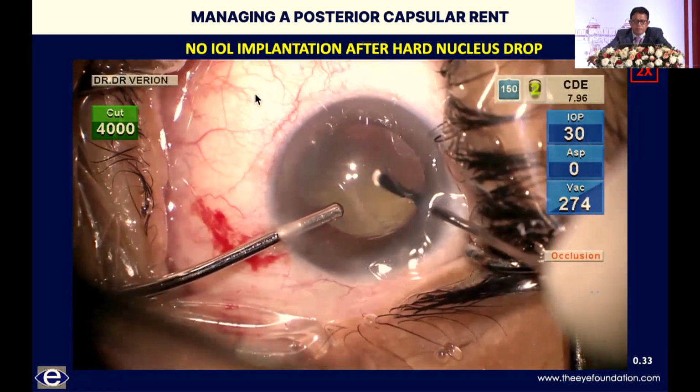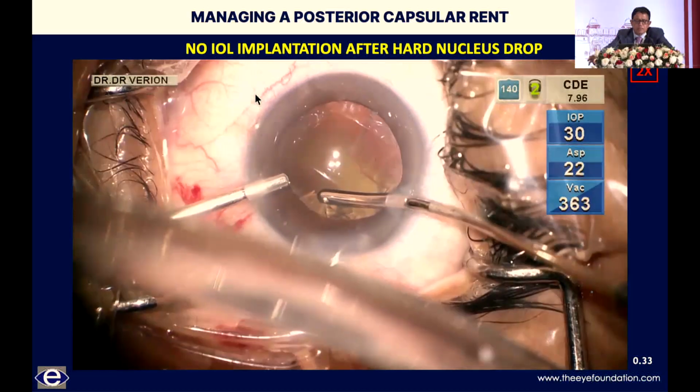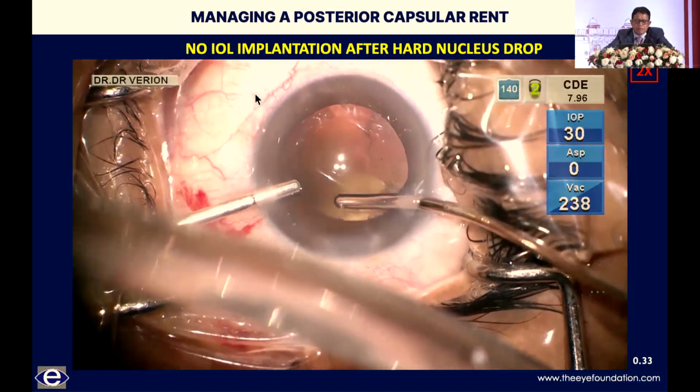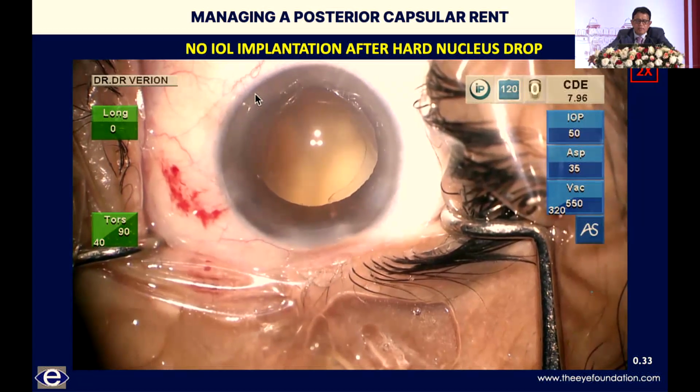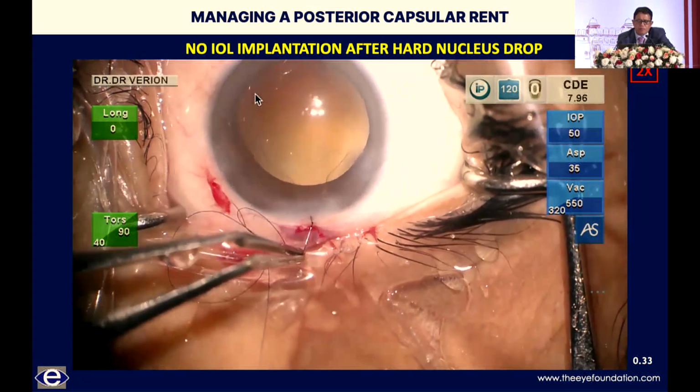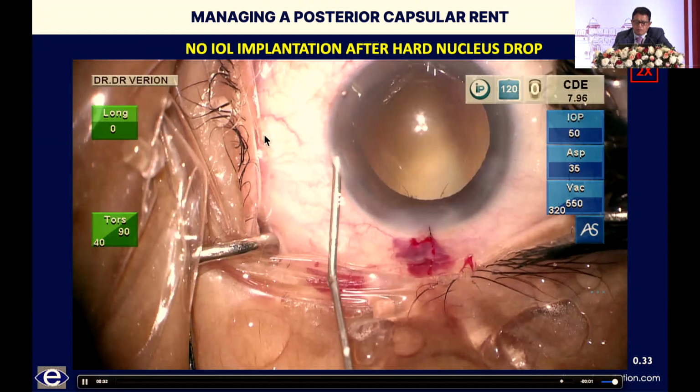quite adequately. But just in case you feel that the patient has to be referred elsewhere and there's going to be a time lag, it might be a good idea not to put the lens in place, because with an intact rhexis, there is a small rhexis runoff over here. Just suture up the incision and then go ahead and refer to the vitreoretinal colleague.